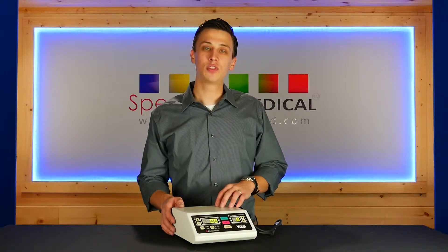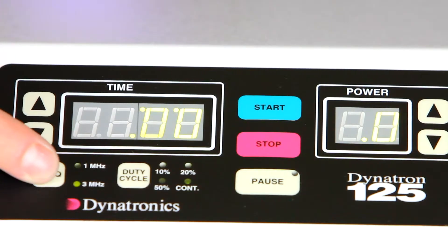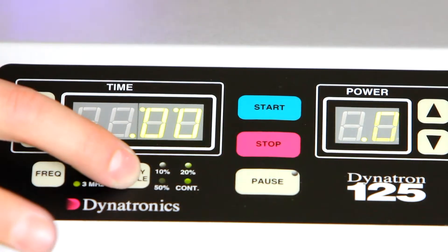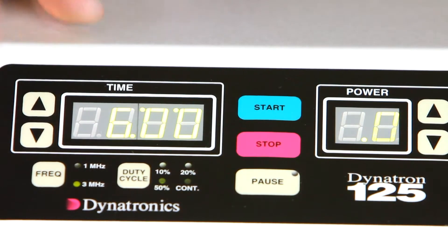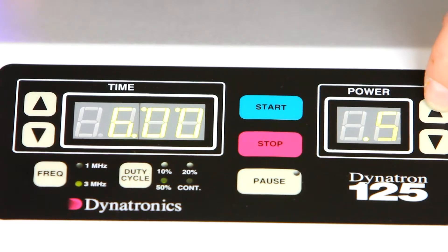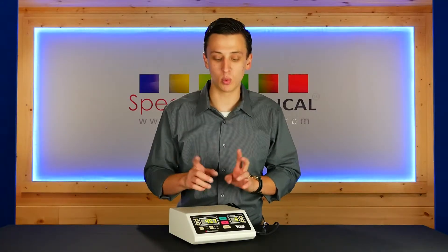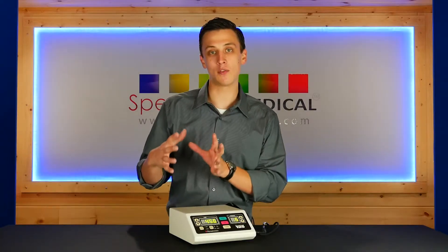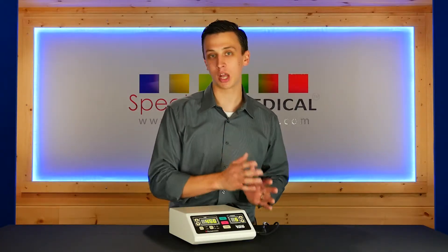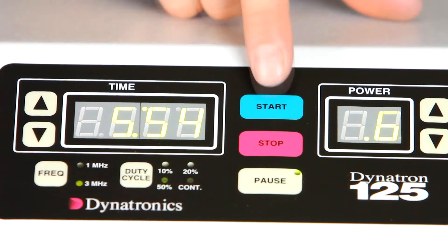Setting up the unit is pretty straightforward, simple, and easy to use. We're going to have our frequency selection here, set our duty cycles, increase our time, set our intensity, and press start. If we need to pause during treatment, we can do so with the pause button. This is going to pause and save all of our settings — it just stops the ultrasound output and stops our time. To resume, we press start.